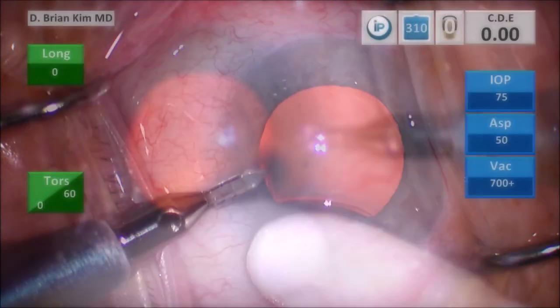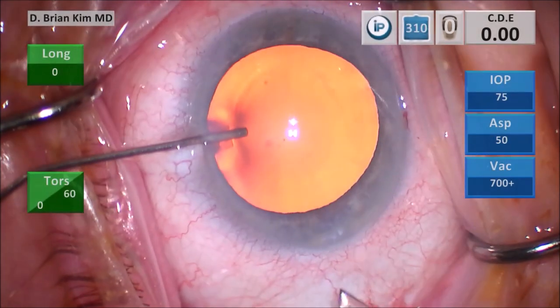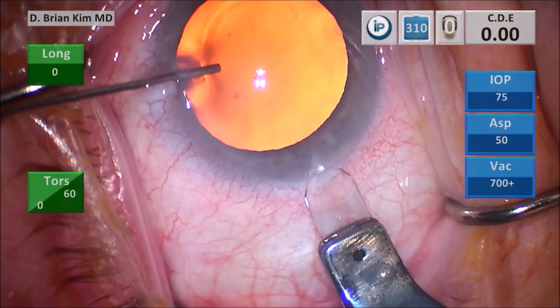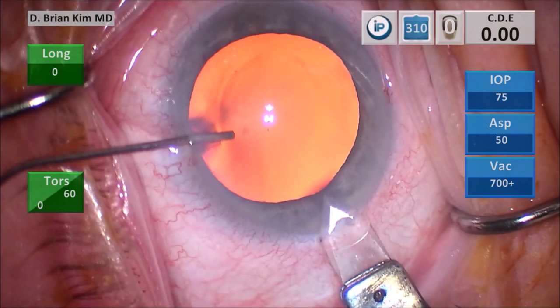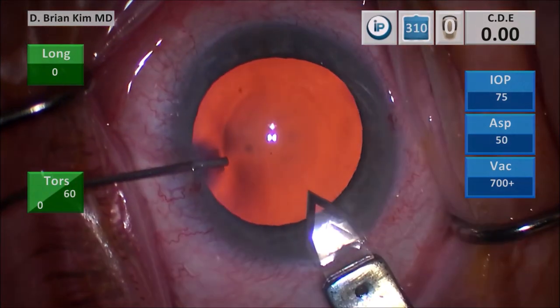Here I'm marking the central cornea and then making my incisions. I'm filling the eye with viscoelastic and making my triplanar corneal incision, making a vertical groove, then tunneling and entering into the anterior chamber. So far, so good. I don't see any evidence of intraoperative floppy iris syndrome.